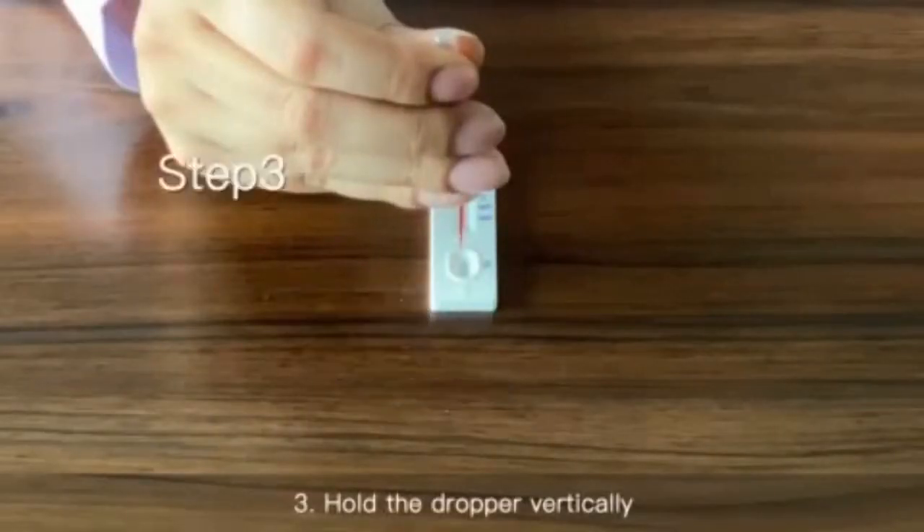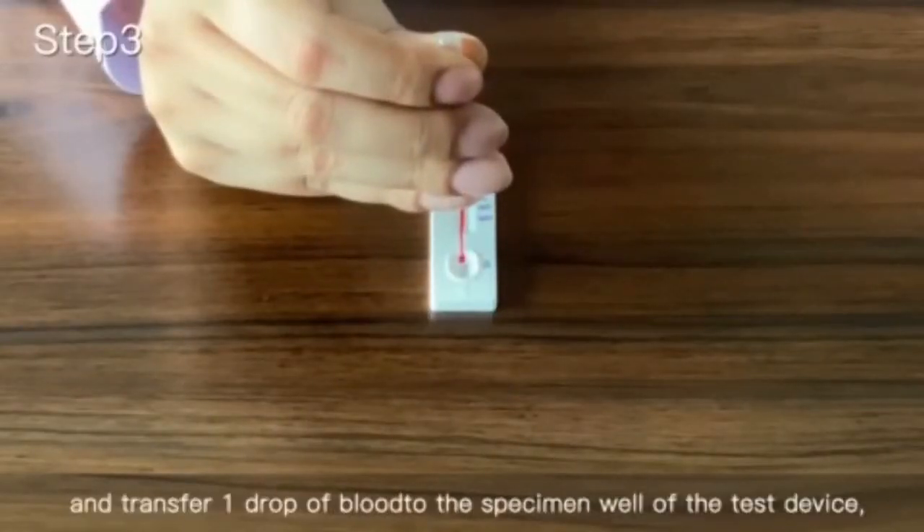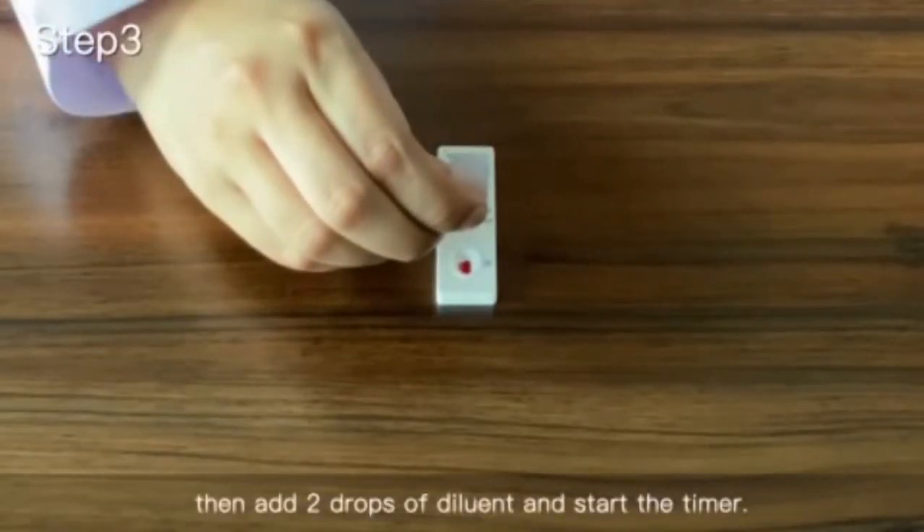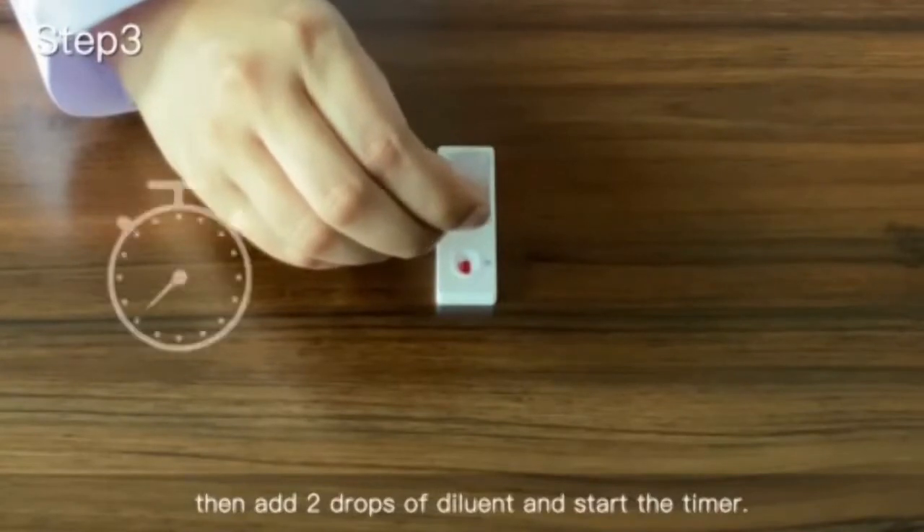Step 3: Hold the dropper vertically and transfer one drop of blood to the specimen well of the test device. Then add two drops of diluent and start the timer.